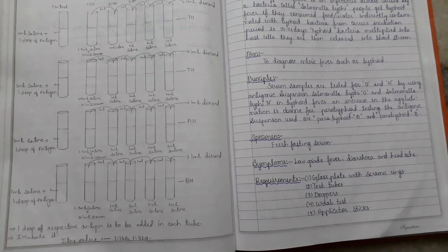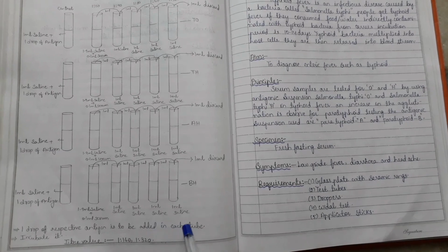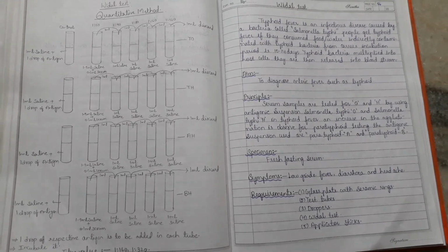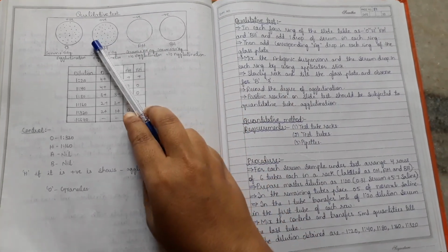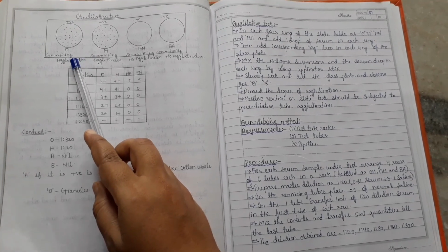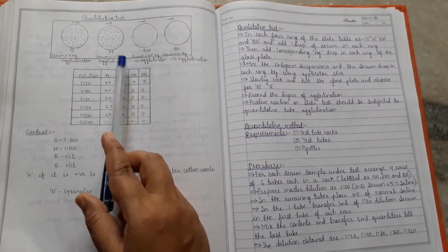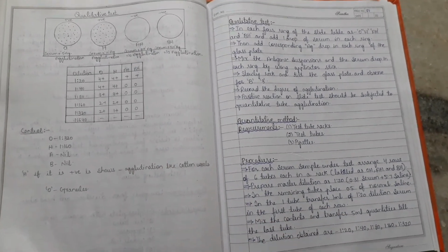One drop of the respective antigen is to be added in each tube. Then we do incubation. So this is the qualitative test: serum plus O antigen, serum plus H antigen, serum plus AH antigen, serum plus BH antigen. Agglutination shows positive, no agglutination shows negative. So this is the procedure.